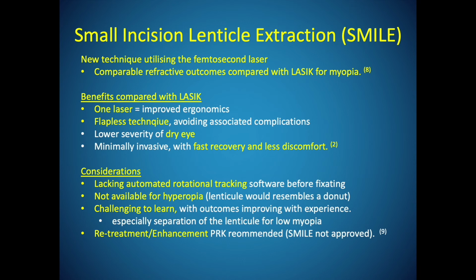SMILE takes advantage of the femtosecond laser with evidence supporting similar efficacy and safety as LASIK. Its minimally invasive approach avoids flap-related complications and there is less dry eye compared to LASIK. Although SMILE is new and still evolving, for the surgeon it's more challenging to learn and there is a lack of rotational eye tracking software. It currently remains unavailable for hyperopes and enhancement is usually done with PRK instead of SMILE.